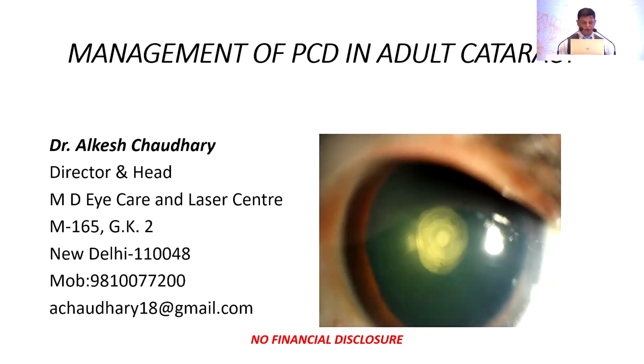Intraoperative OCT is important. Type 1 tells us an intact PC with clearance between the PC and the opacity, so hydrosection can be performed in these cases. Type 2: intact PC in the periphery, inability to detect it in the center, dense opacity, extensive shadowing, and inability to delineate the PC. Type 3: avoid hydrosection.